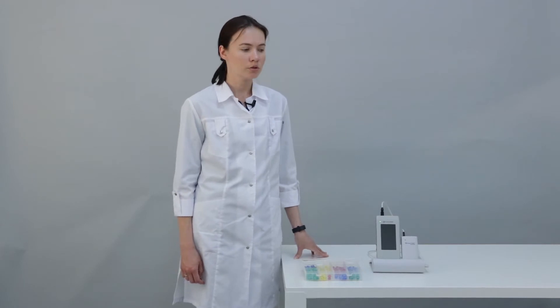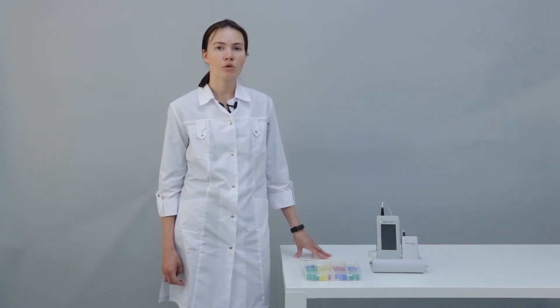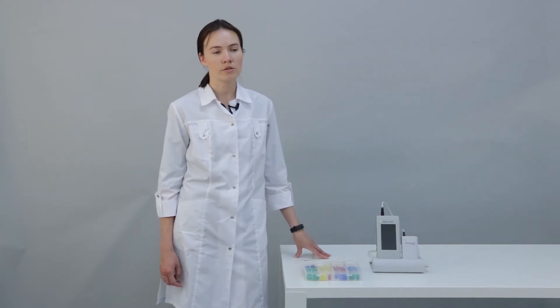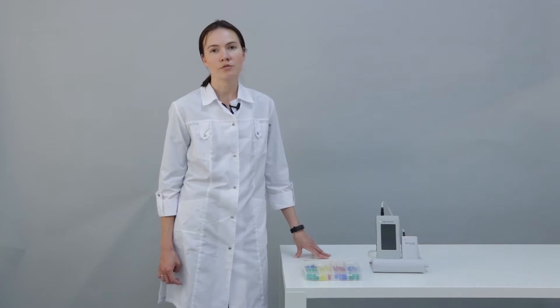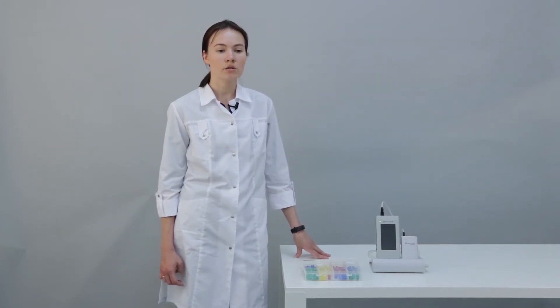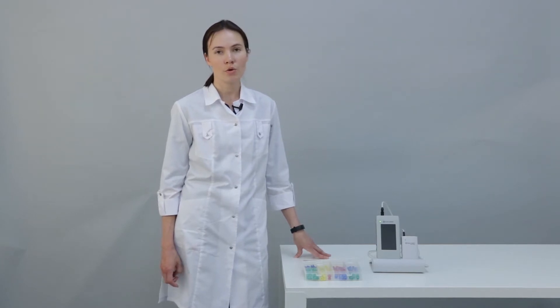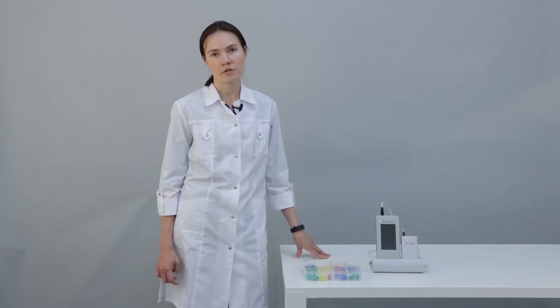We will use the AudioSmart device manufactured by Neurosoft. This device allows us to perform transient evoked otoacoustic emission and distortion product otoacoustic emission tests. It takes very little time to perform and it allows us to evaluate the state of the inner ear of our patient, particularly the state of outer hair cells.